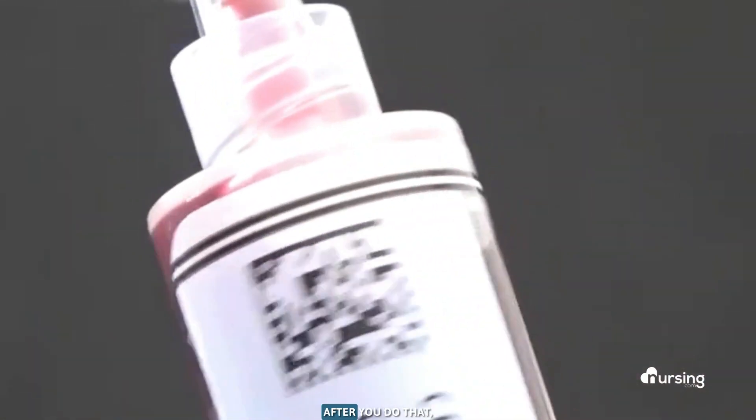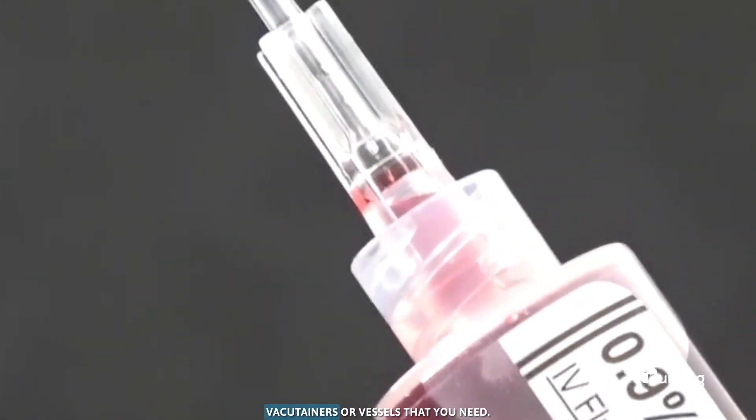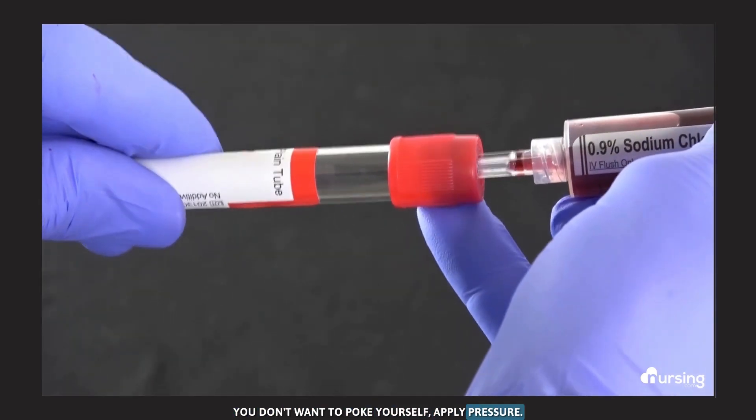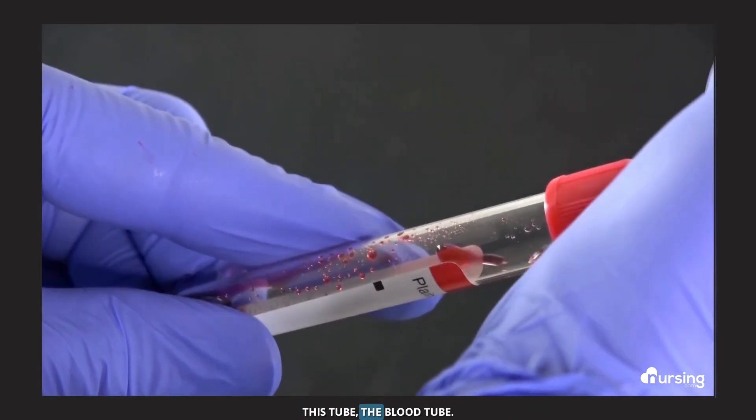Now that you've got your sample, take this blunt tip plastic cannula and attach it to the sample syringe. After you do that, grab the necessary vacutainers or vials that you need. Use that blunt tip — you don't want to poke yourself. Apply pressure, and then you're going to fill up this blood tube.